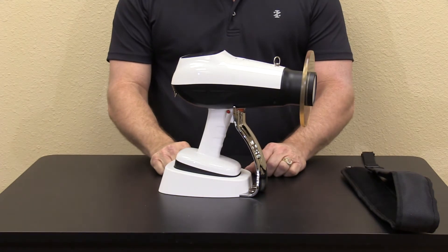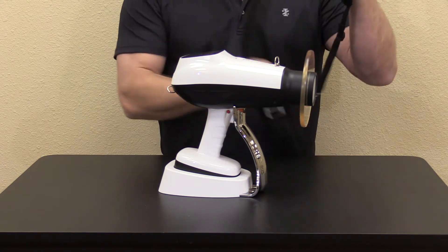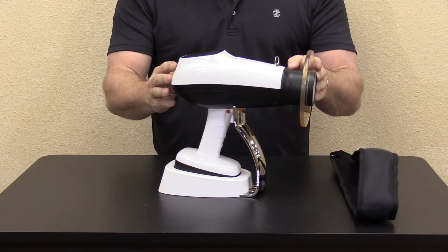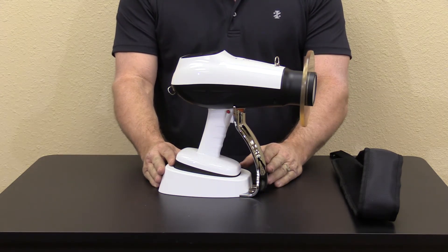This unit also features convenient carry strap points where you can wear the unit around your neck if you choose. So no more dropped x-ray units. A padded travel case and an emergency backup battery are also included.